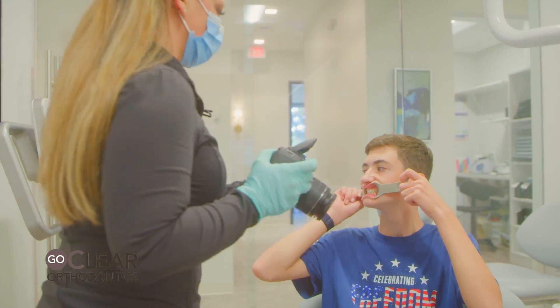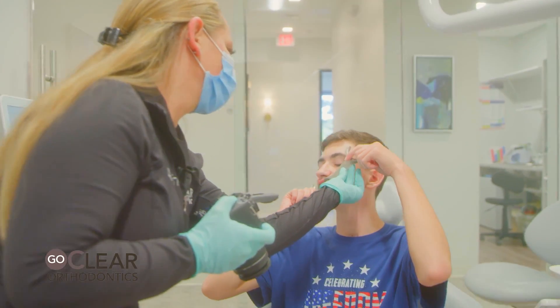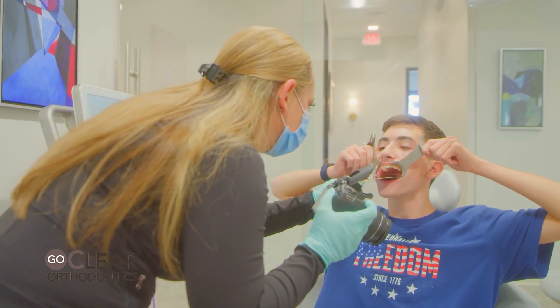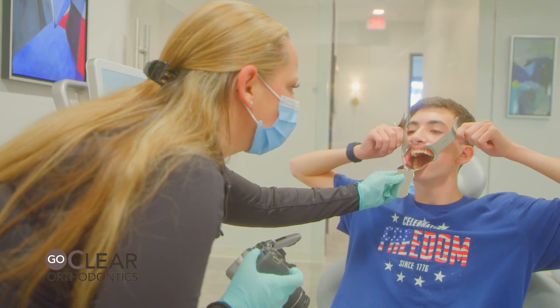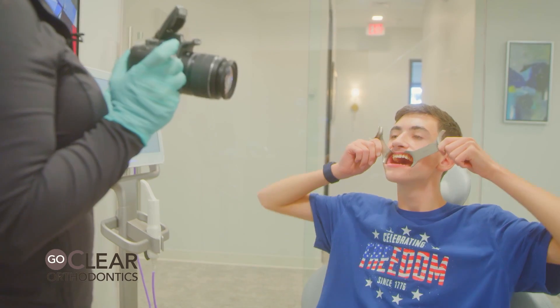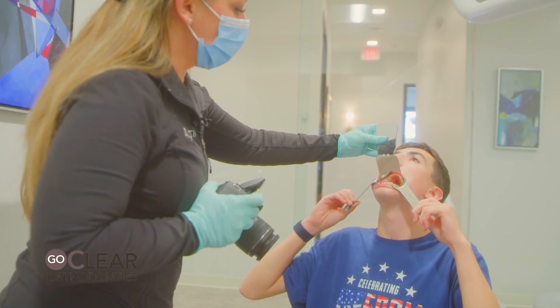Now turn your head to the right. Leave the retractors in, but swoop up like this. Make sure those elbows are spread and open big — as big as you can. Make sure the mirror is tilted up; the mirror can almost touch the back of those second molars. Now pull these down to your bottom lip. On this one, put your chin up. Again, touch the back of those second molars.